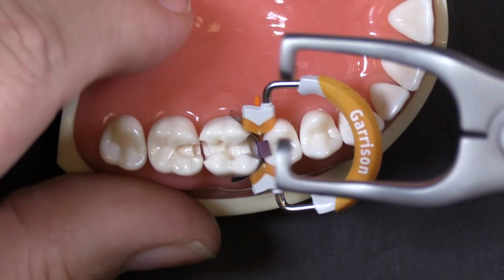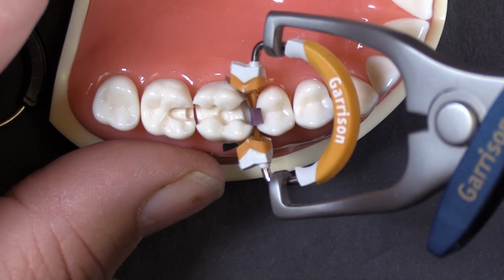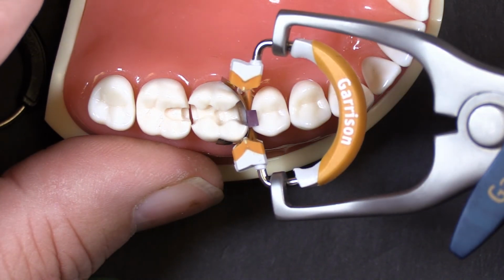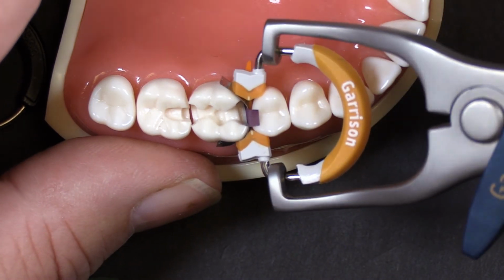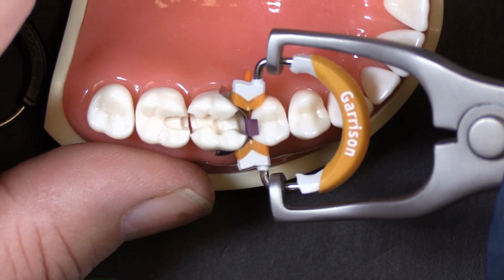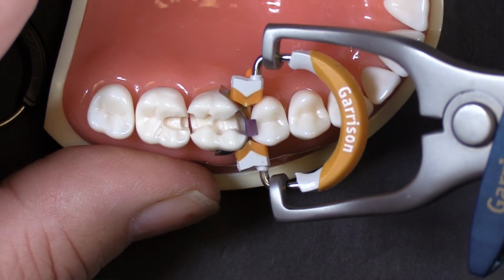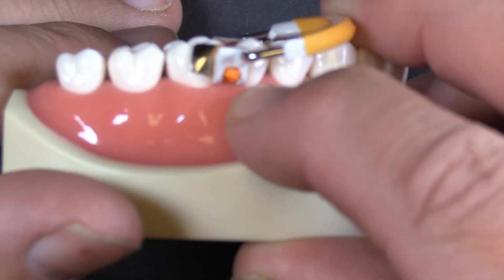By doing that, I'm contacting that band in a way that helps hold it in position while I rotate and then descend and push down as far gingivally as the ring will go. That's a retention suggestion: always make sure that you've applied a little bit of force towards the gingiva on the ring to make sure that it is seated down as far as it'll go.